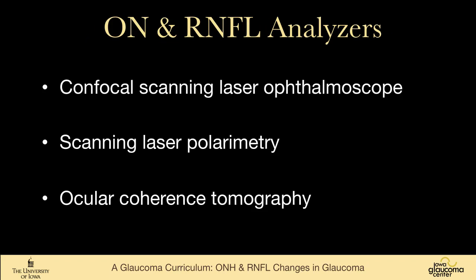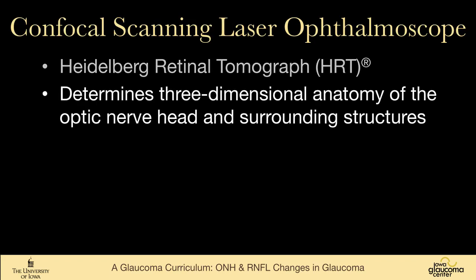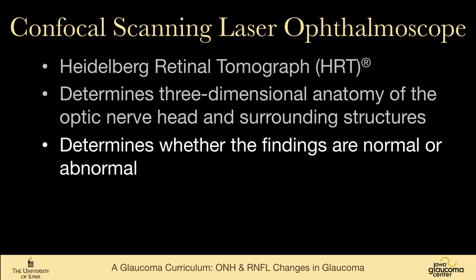Now let's close by talking about optic nerve fiber layer analyzers. These have become very important in the practice of glaucoma. In our world of glaucoma, there are basically three forms: confocal scanning laser ophthalmoscope, scanning laser polarimetry, and optical coherence tomography. So confocal scanning laser is the Heidelberg retinal tomograph, or HRT. It determines three-dimensional anatomy of the optic nerve head and surrounding structures, and determines whether these findings are normal or abnormal.